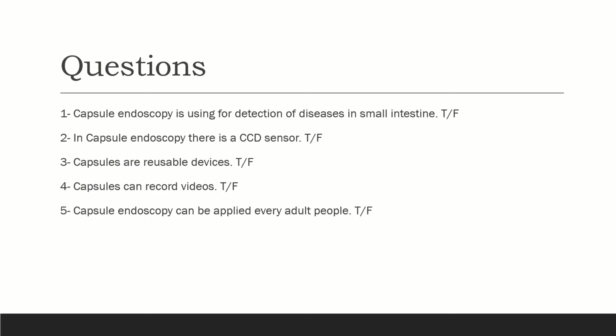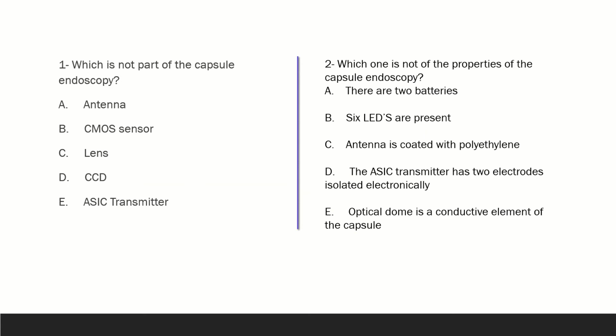Question 5. Capsule endoscopy can be applied to every adult. It's false. Question 1. Which is not part of the capsule endoscopy? It's D. CCD.